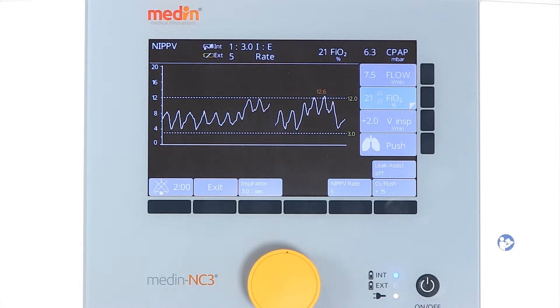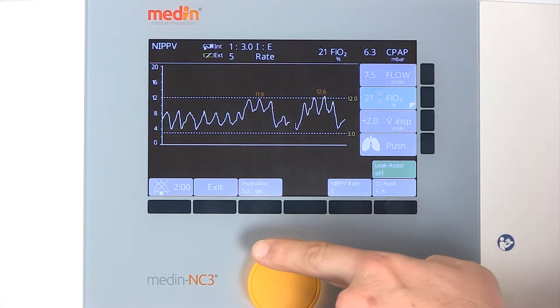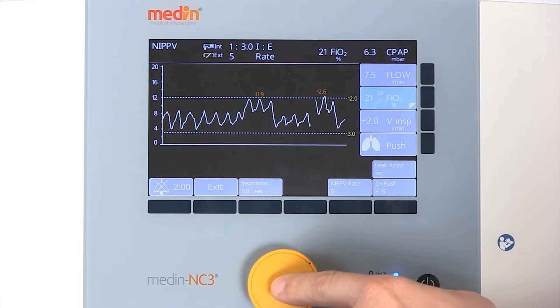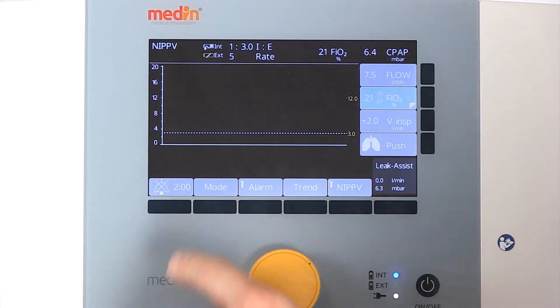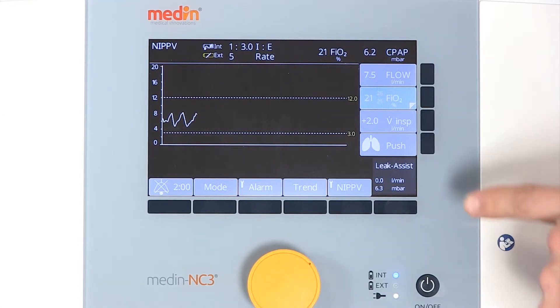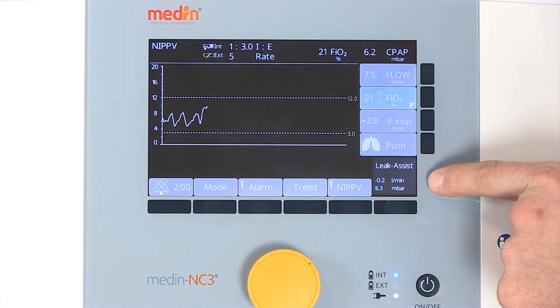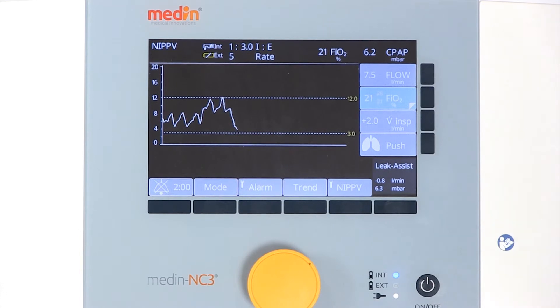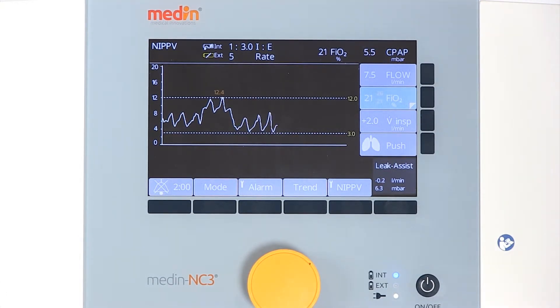The leak assist function for automatic leak compensation can be activated if required. When leak assist is activated, the current CPAP pressure is saved as a target pressure. If there is a difference of more than 0.5 millibars from the target pressure, leak assist will increase or decrease the flow to maintain the target pressure.